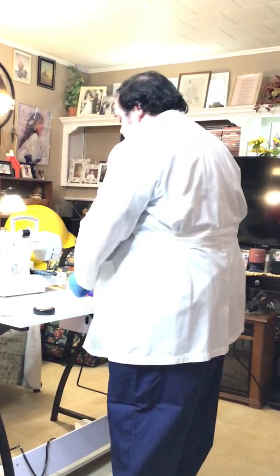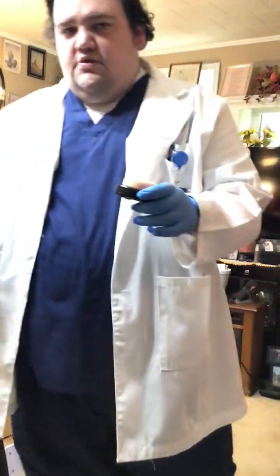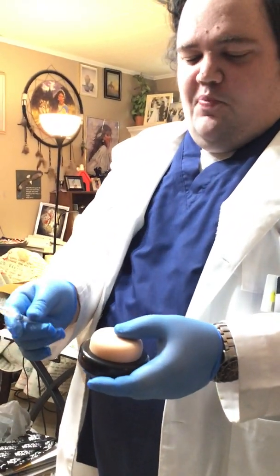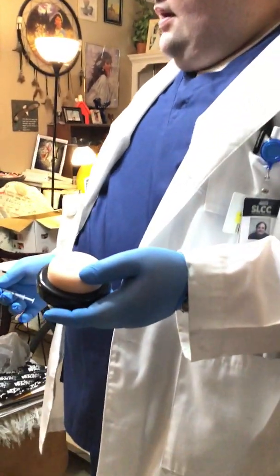Once I find that area, and this sometimes can be the most tricky one. Now, I only have 1 tuberculin syringe, so I couldn't practice this. So this is going to be the real deal. I was not able to practice this one, so hopefully it works. But I'm going to cleanse the area and let it dry.